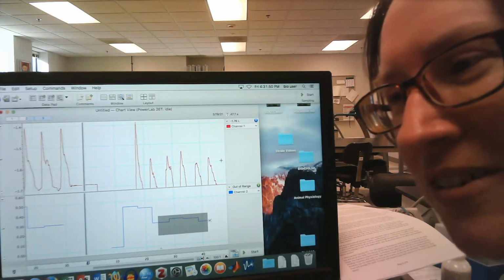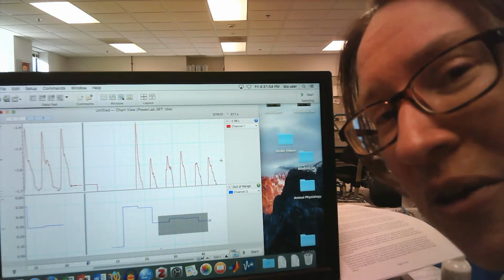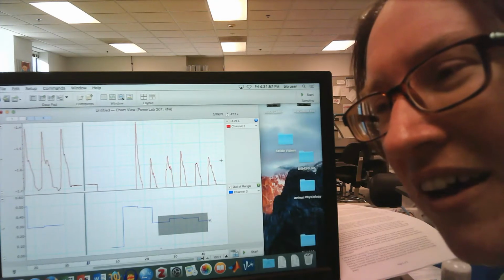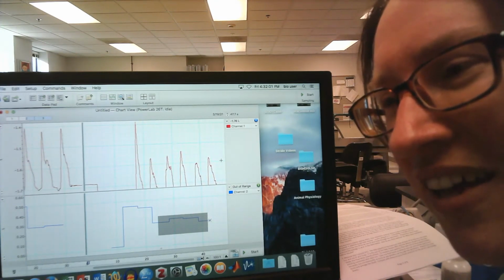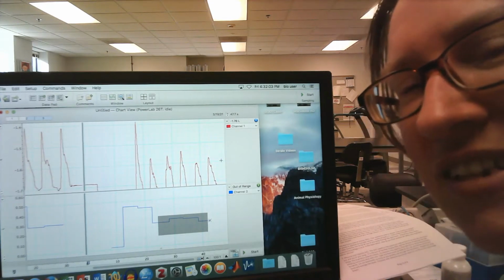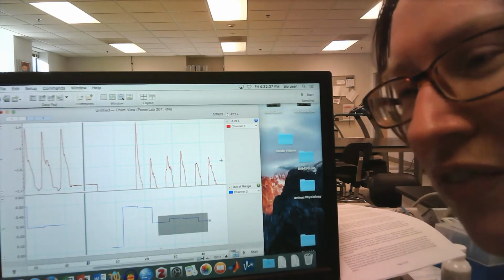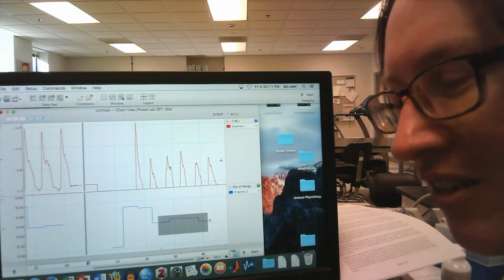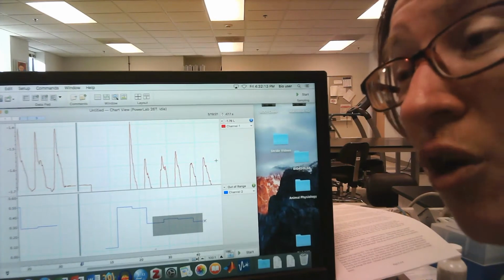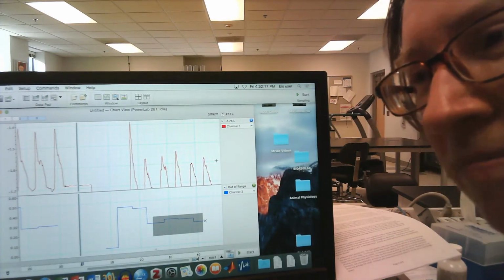And you can probably imagine a similar exercise for measuring your inspiratory reserve volume, and collectively that would allow you to figure out what your overall vital capacity is. So to what volume you can maximally breathe in, to what volume you can exhale. So what's the total volume that you can exchange in your lungs maximally.